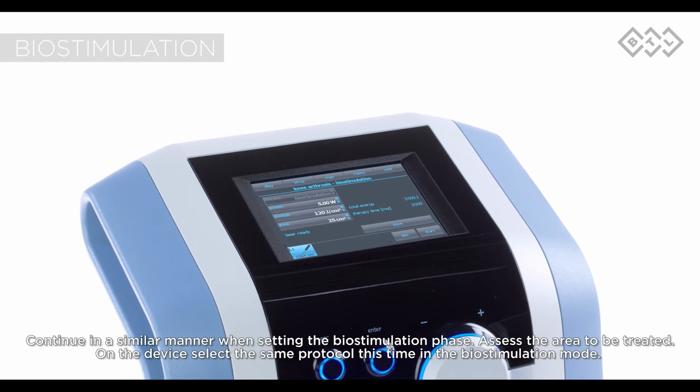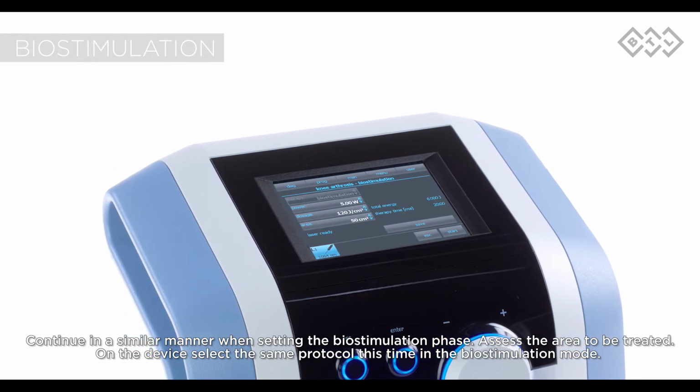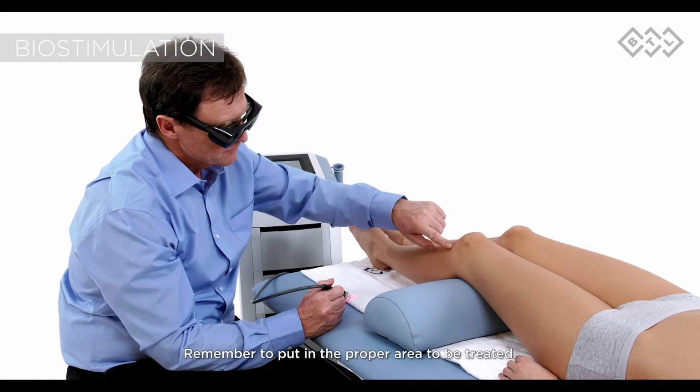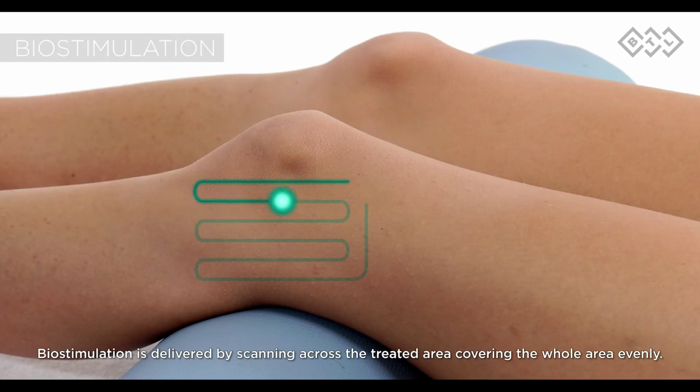Continue in a similar manner when setting the biostimulation phase. Assess the area to be treated. On the device, select the same protocol, this time in the biostimulation mode. Remember to put in the proper area to be treated. Biostimulation is delivered by scanning across the treated area, covering the whole area evenly.